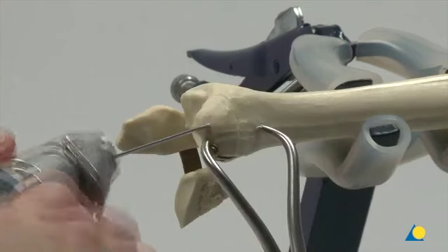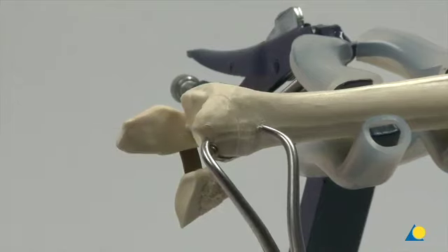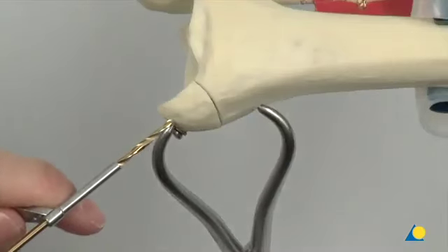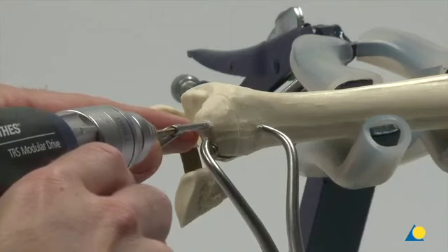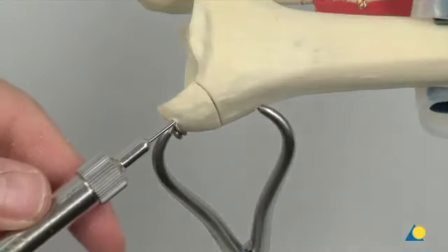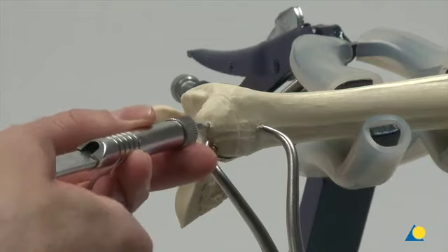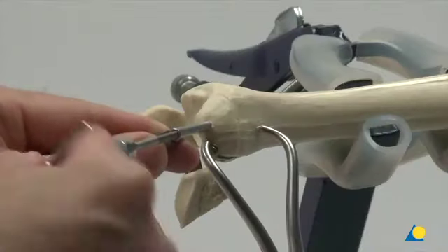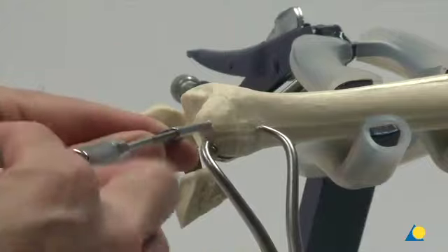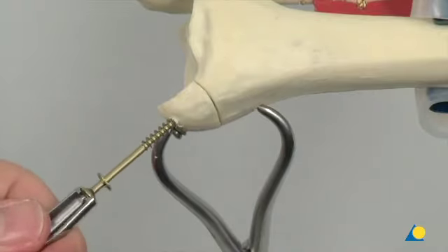The 4.0 mm partially threaded cancellous screw is inserted with a washer to achieve interfragmentary compression. The K wire is removed. The hole for the second screw is drilled with the 2.5 mm drill bit in the same position as the channel of the previously removed K wire. The required length of the screw is measured with the depth gauge. The 4.0 mm cancellous tap with appropriate sleeve is used to create the threads, and the second 4.0 mm cancellous screw is inserted in the same manner as the first.